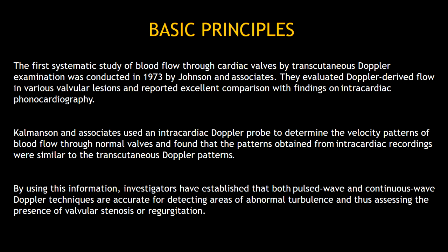The first systematic study of blood flow through cardiac valves by transcutaneous Doppler examination was conducted in 1973. They evaluated the Doppler-derived flow in various valvular lesions and reported excellent comparison with findings on intracardiac phonocardiography.